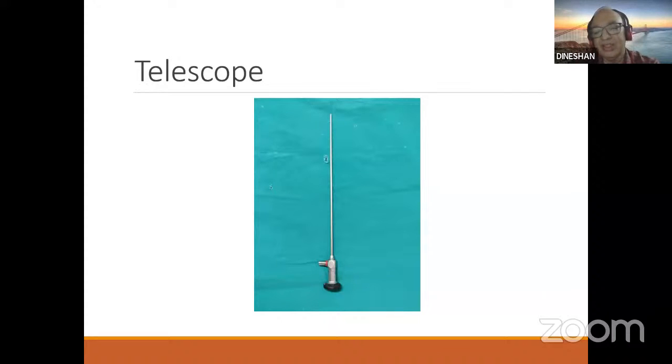Previously, cystoscopy was very primitive with the old battery operated light system. And now with the introduction of the rod lens system, the Storz telescope has revolutionized lower tract endourology.